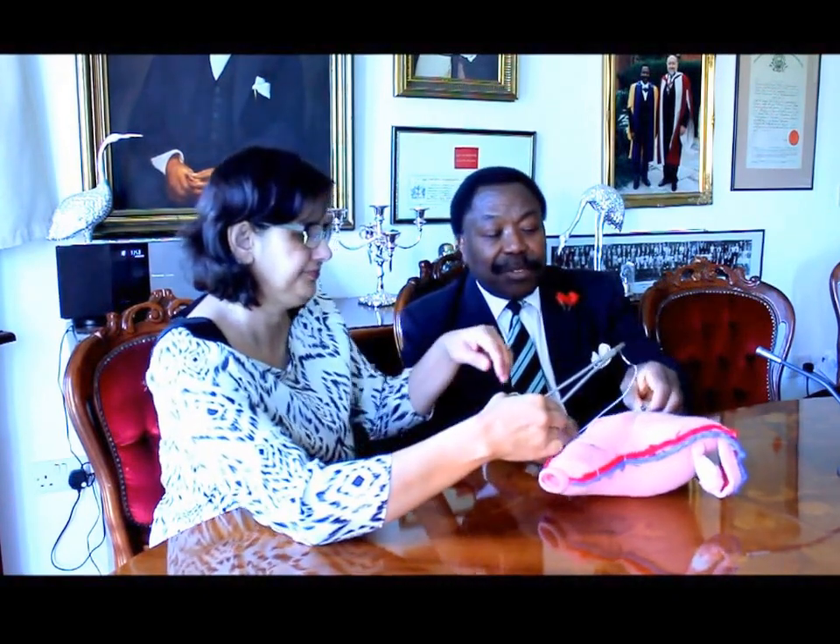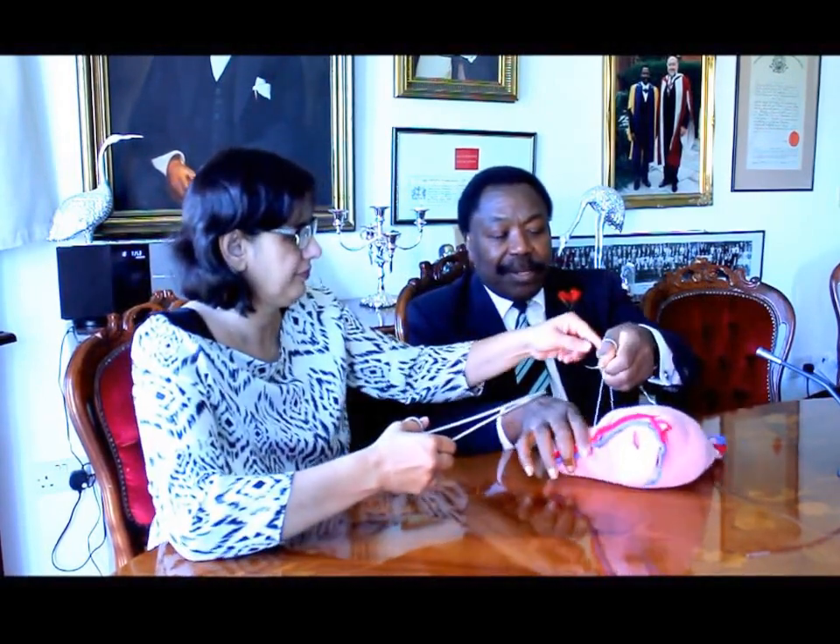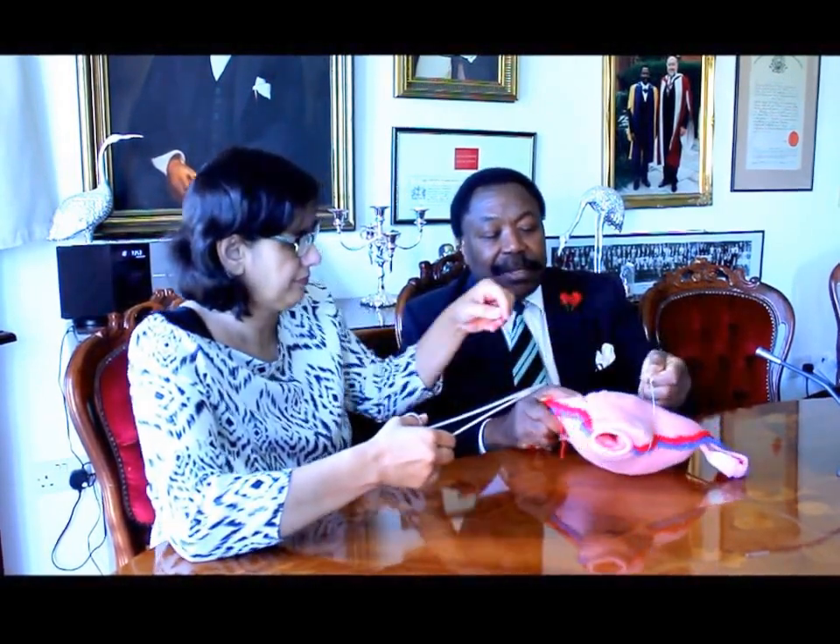Now the surgeon goes through the cavity 3 cm above the incision margin, posteriorly behind the vascular pedicle. You can see the two limbs of suture — one on each side — so both vascular systems have been occluded by this suture technique.